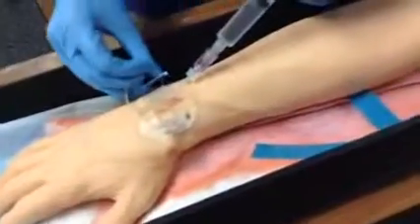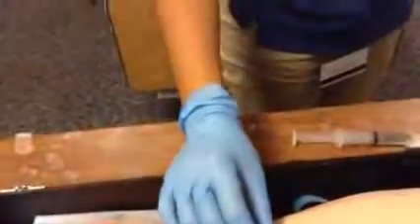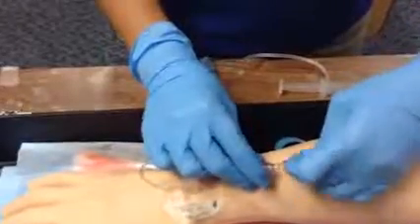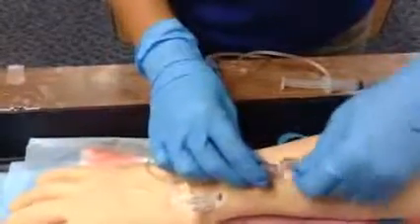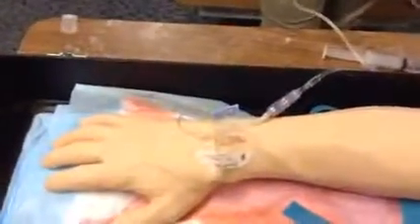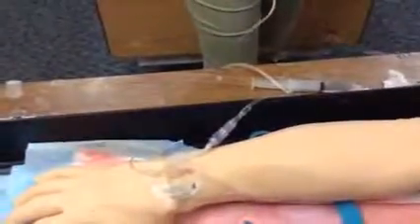Now we're going to go ahead and administer the drug. And as we know, we're going to infuse this over 30 minutes. And the drip rate will be 17.